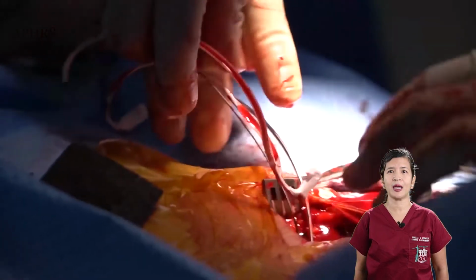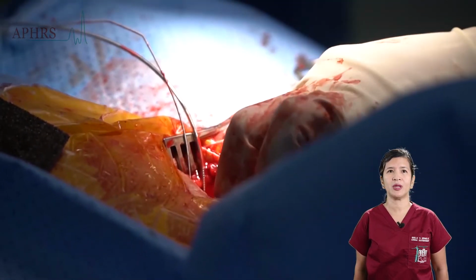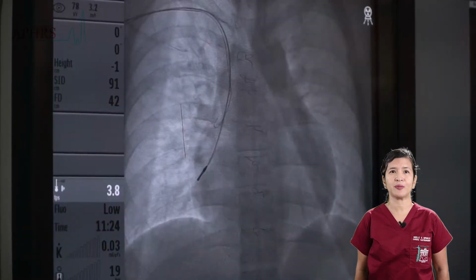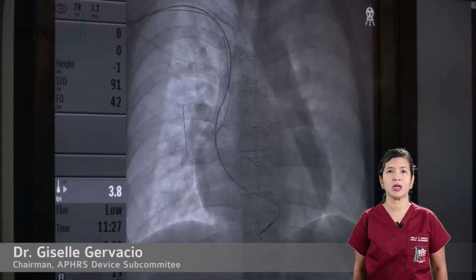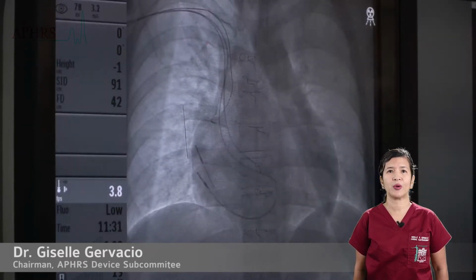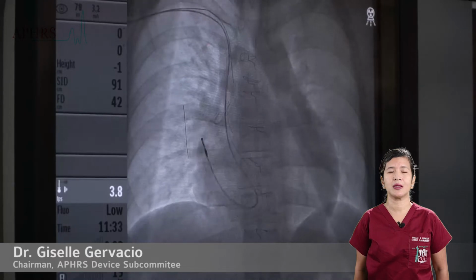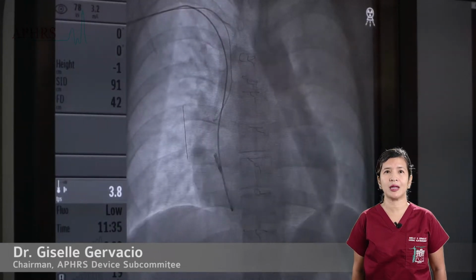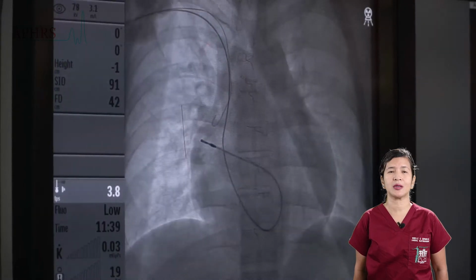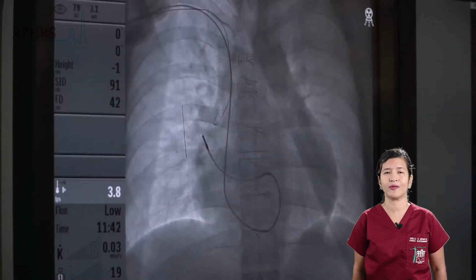Pressure is then applied at the point of entry to minimize back bleeding. The lead may then be prolapsed across the valve as such, trying to snag the tip on a fixed structure, prolapsing the lead. This is done by pulling the stylet rapidly out of the lead, which then causes the lead to jump across the valve.